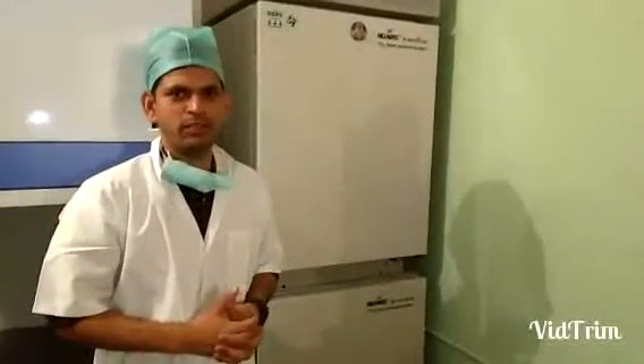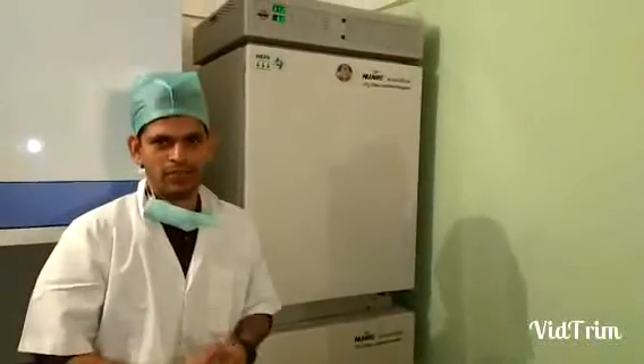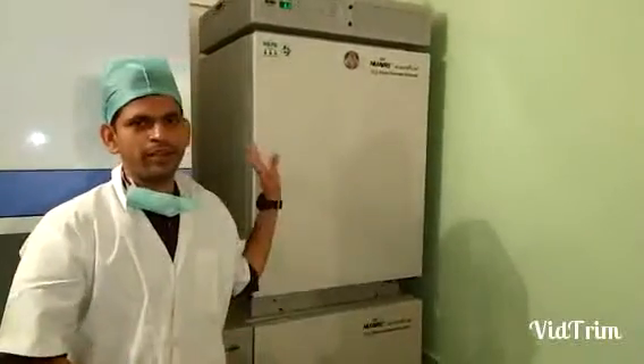Hello, I am Saipur Sargundiating. I am Chief Embryo Worker at Dr. Malapani's IVF Centre. Today I am going to give you a brief idea about the CO2 Incubator.